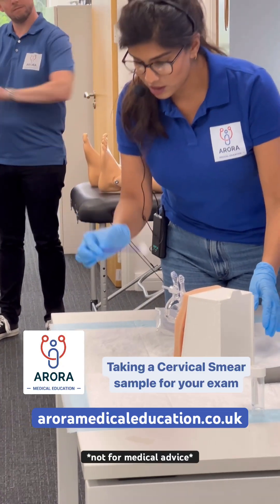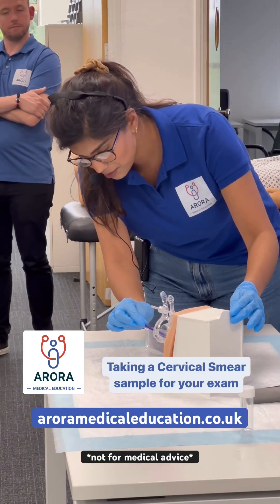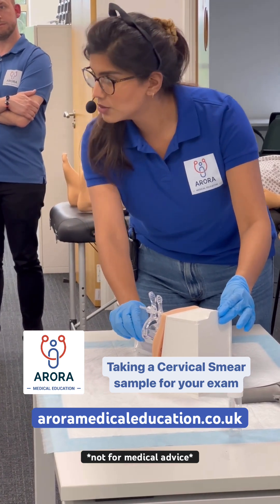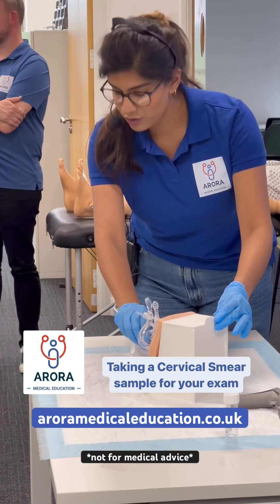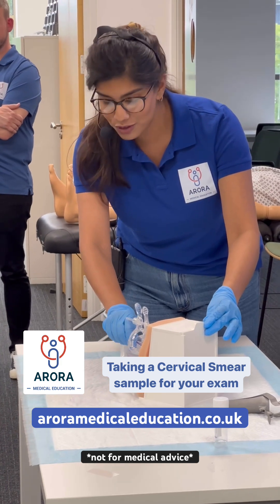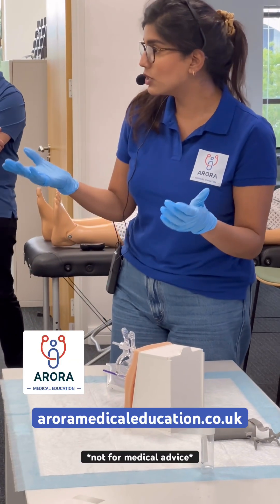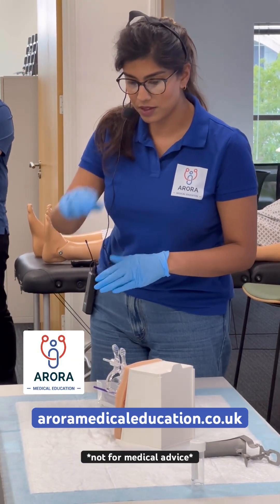I'm just going to take a sample now. So the tip of the brush goes into the cervical os. And how many rotations do you think? Five — four, five. Five full rotations. And do we know why? So we've got an adequate sample from the cervix.